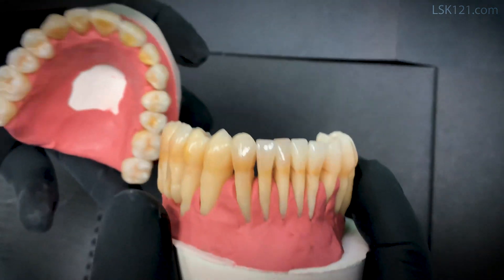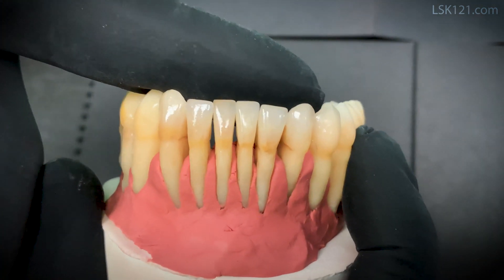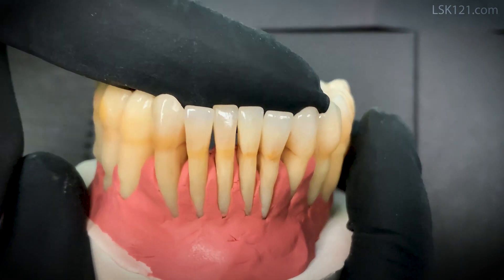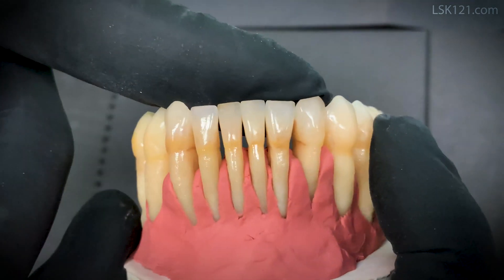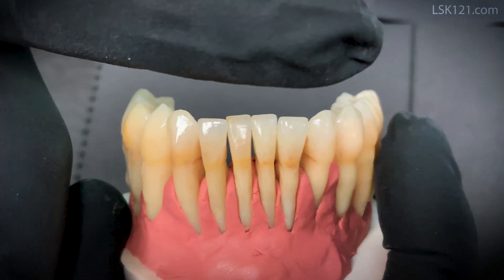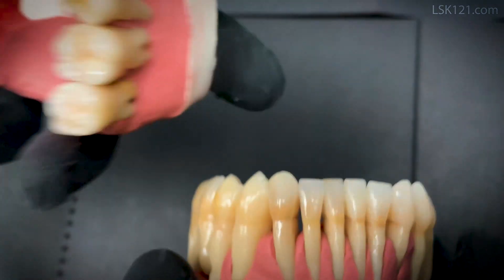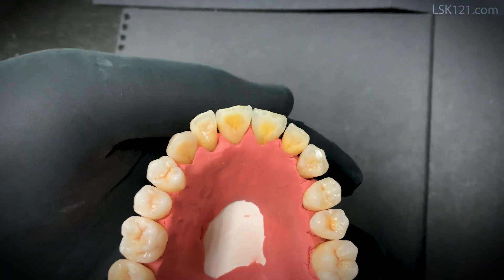Alright, so this is the lower 6-unit. Same thing — we created it as natural as possible from the cervical area all the way to the gingiva, and here is the occlusion view.